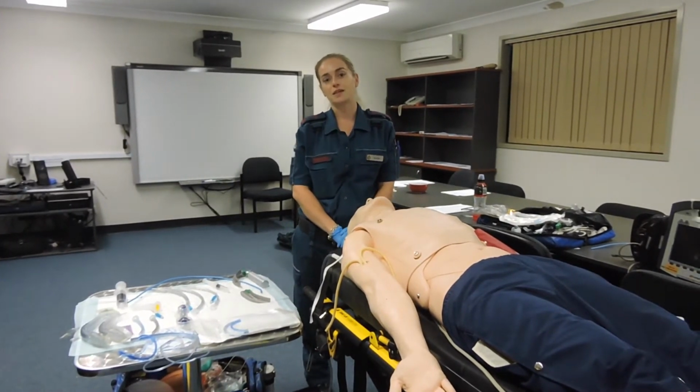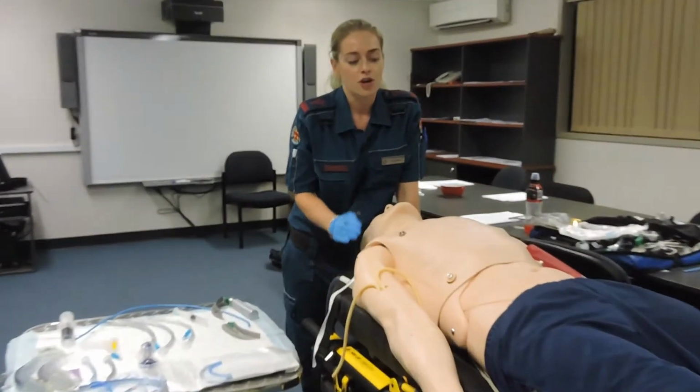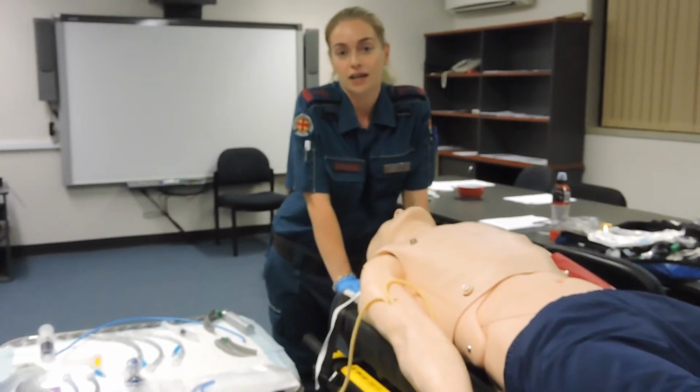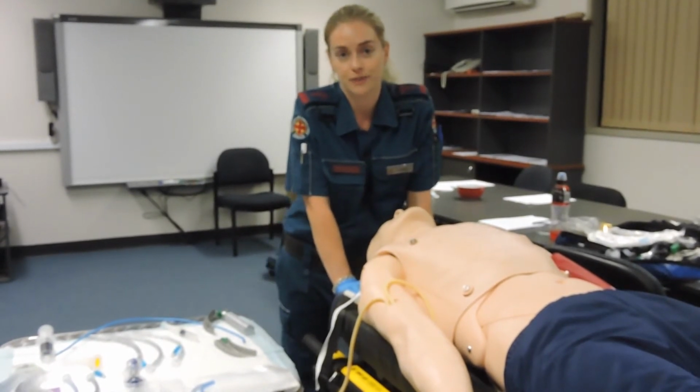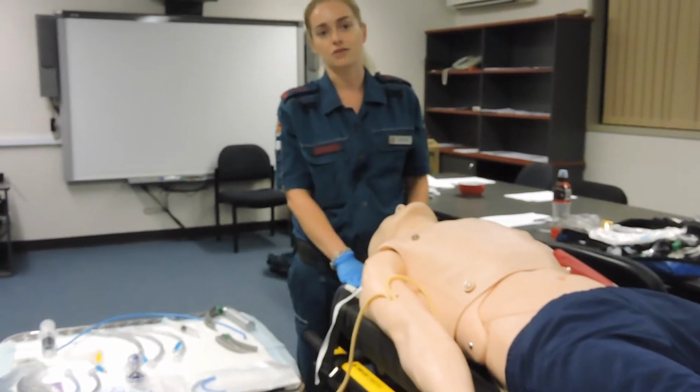The most important thing to understand about the failed intubation drill is it's an algorithm that allows a clinician to easily know what to follow and what to do in a dire, can't ventilate, can't intubate situation. I want to briefly talk about the importance of this before we go into the details of it.